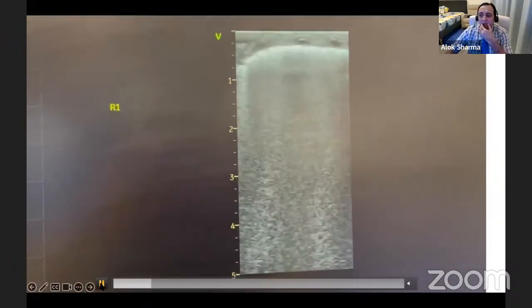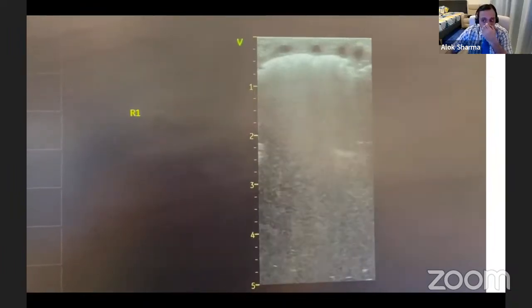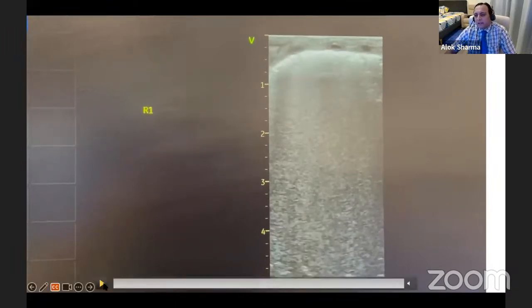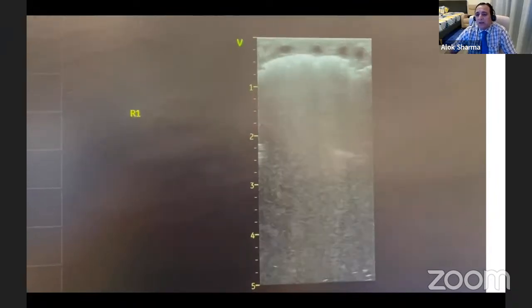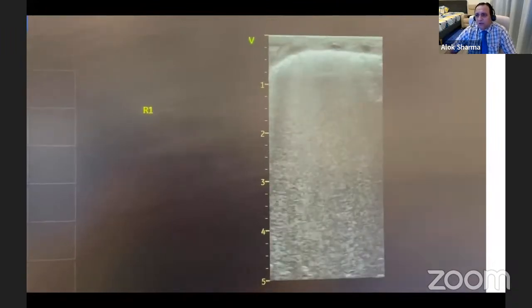Sarah has asked, the lungs look very dense. Correct. It's a whiteout. I would agree. But by definition, and I will be covering that today, when you look at one lung field, R1 or R2, and you see this kind of pattern, we call it AIS. If you look at the definitions by Jing Liu, he says that if you see this in all six lung fields, on the right or the left side, then he would call this a white lung pattern. So for all practical purposes, you should see this pattern in all lung fields for it to be correct.